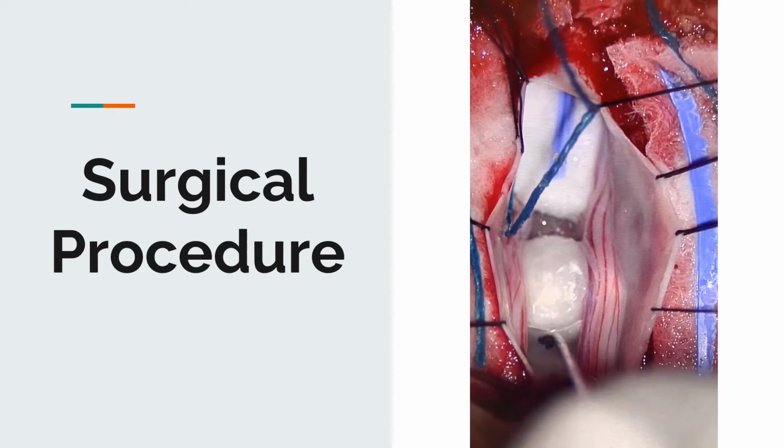Based on the preoperative X-ray, laminectomy was performed at the L5-S1 level. The dura was opened and the nerve roots and pia were identified. At the superior portion of the exposure, a pearl-like mass was identified. The mass was able to be mobilized inferiorly and did not seem to be densely adherent to any neural elements.